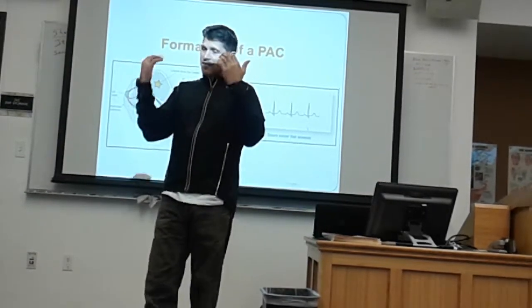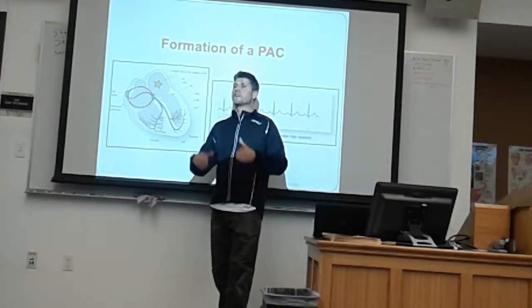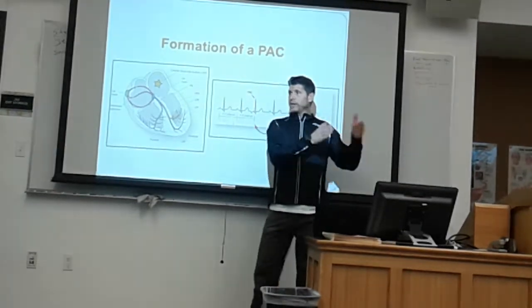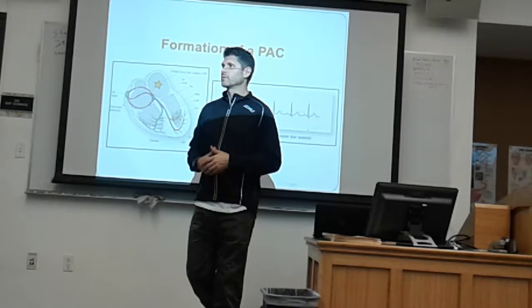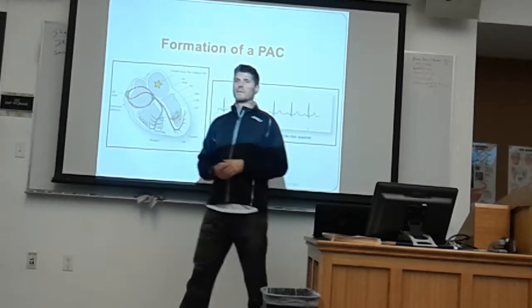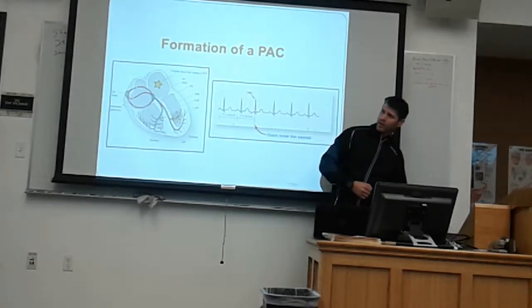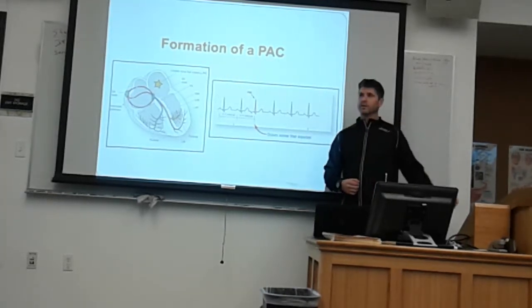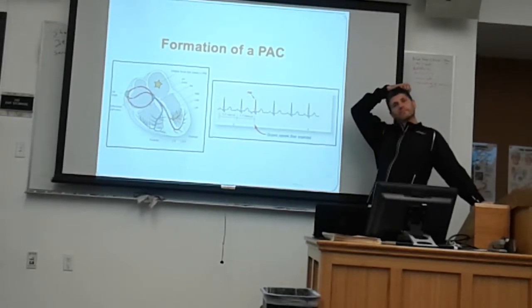If it's a singular PAC and it didn't perfuse, we don't care. If it's a frequent PAC and it is not perfusing, we do start to care, because then that'll start to affect their cardiac output. Rarely do the conducted PACs not perfuse, but it's very possible that it could.